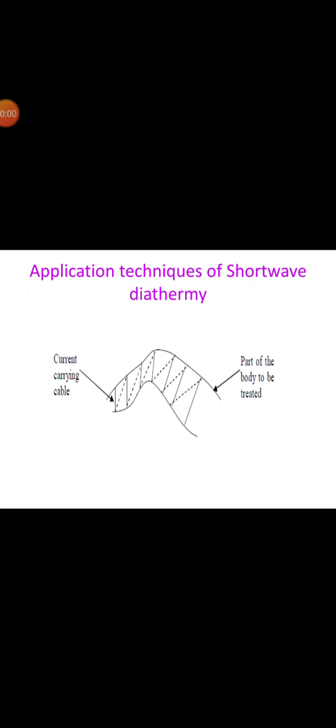It is also a modality about which many practitioners have significant reservations, some of which are well-founded and others are not. Short wave diathermy uses short waves of 10 to 100 megahertz and electromagnetic energy to cause an increase in tissue temperature. To avoid radio frequency interference with communication frequencies, the Federal Communications Commission regulates the frequencies of short wave diathermy available and has allocated three frequencies for medical use: 13.56, 27.12 and 40.68 megahertz.